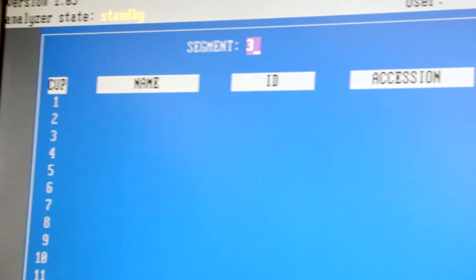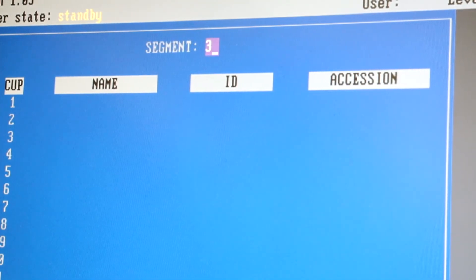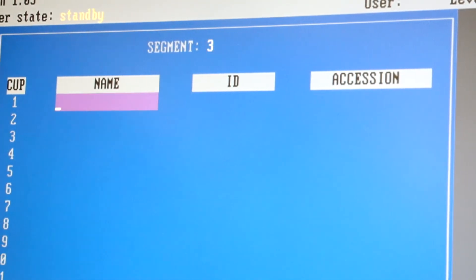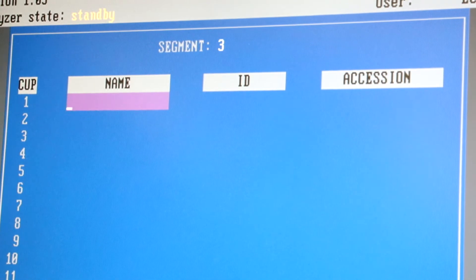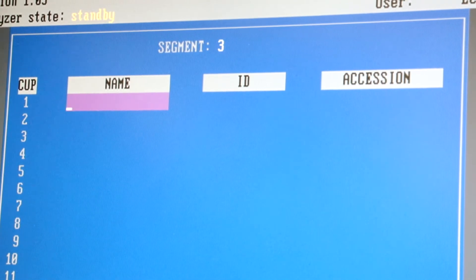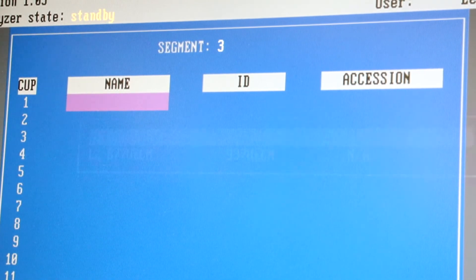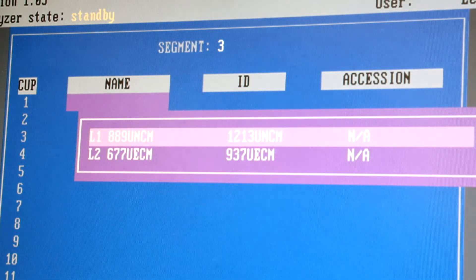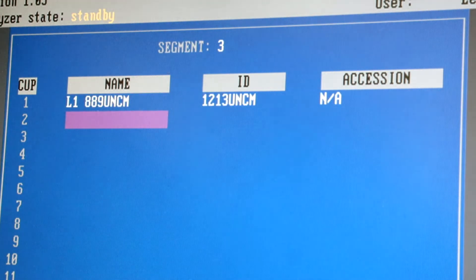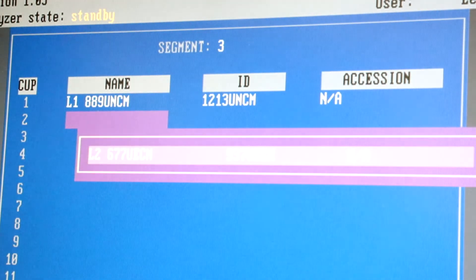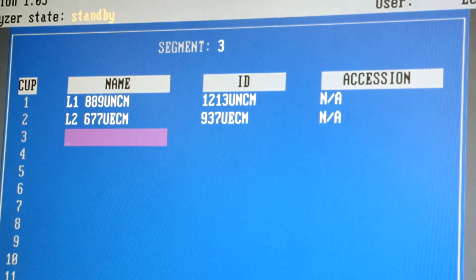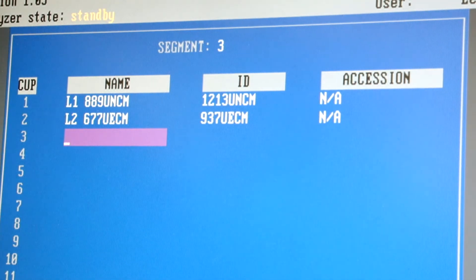You will need to give the segment a number and then press Enter. If a number is already in use, it will tell you and you will need to select a different number. Next, hit F12 to pull up a list of patients with orders and select L1 and on the next line, select L2.